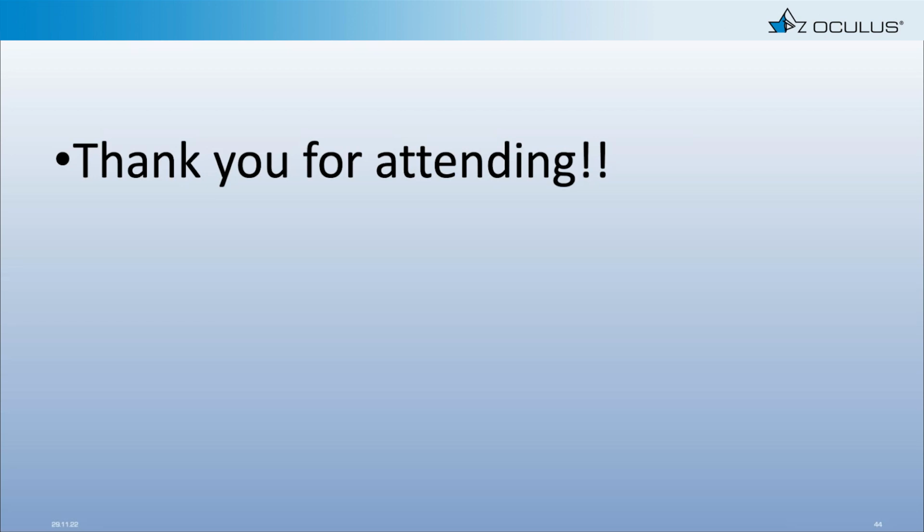Yeah. So, obviously you can fit a patient strictly off of diagnostic lenses. And of course, then what happens is your first lens becomes your topographical information, if you will. But then you have to put on a second lens and maybe a third lens. And like you said, the process for the patient, it's cumbersome, it's not enjoyable. And you're left with nothing in your chart about that patient's ocular surface other than this lens was too shallow, this lens was too shallow, whatever.